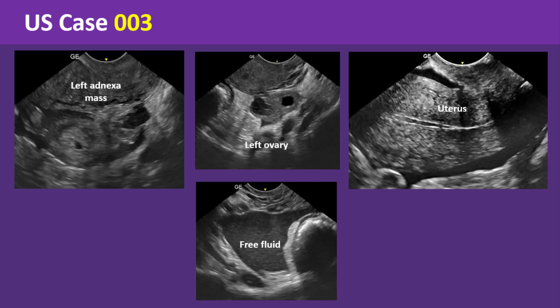The uterus is average in size and showing minimal endometrial fluid collection. There is no definite intrauterine gestational sac. The right ovary is seen and is average in size.